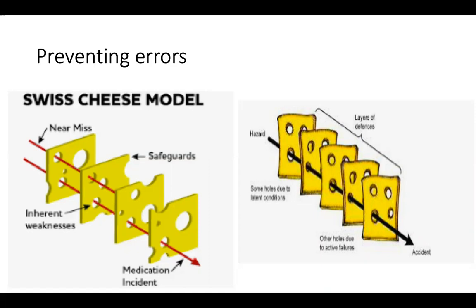And then my emergency drugs, I never put them close to my induction agents. They're always either on top of the machine or on the drug trolley. And I know exactly where they are if I need them. That method of assigning drugs to certain places is part of a safeguard. So it helps you prevent giving the patient a wrong drug. So I know when I'm reaching for my induction drugs, I go to the left. When I'm reaching for my emergency drugs, I go to where the emergency drugs are. So I'm never going to give adrenaline by mistake when I'm intending to give fentanyl.